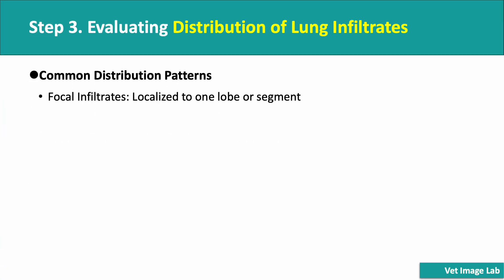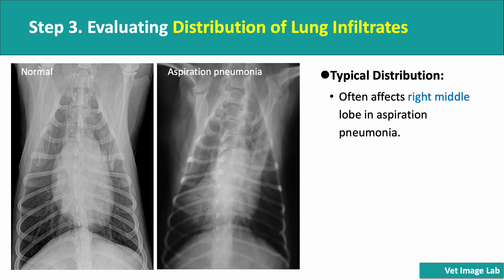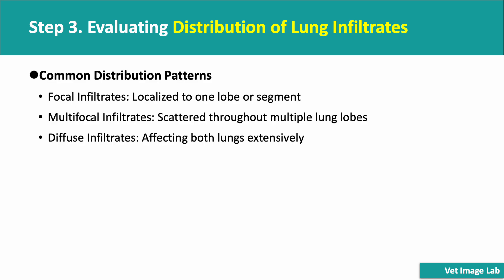Now let's move to Step 3: evaluating the distribution of lung infiltrates. The location and spread of infiltrates on X-rays can give us crucial clues about the underlying cause. If the infiltrates are focal — meaning confined to a single lobe — we often suspect conditions like lobar pneumonia or neoplasia. Here we have an example of a focal alveolar infiltrate. This dog has aspiration pneumonia. Notice how the opacity is concentrated in a specific region rather than being widespread. In aspiration pneumonia, infiltrates commonly affect the right middle lung lobe, as aspirated material tends to settle there due to gravitational and anatomical factors.